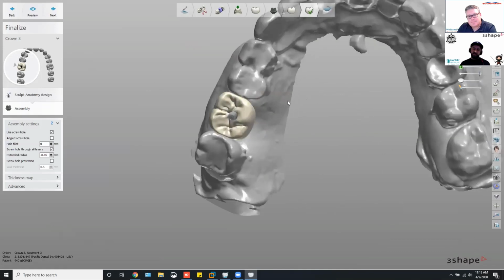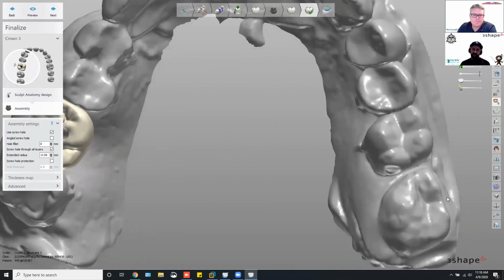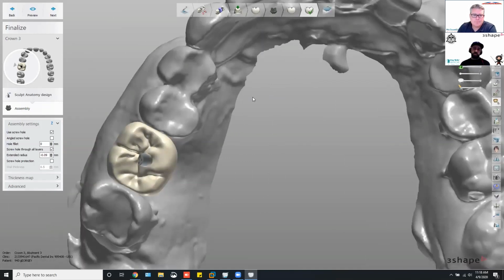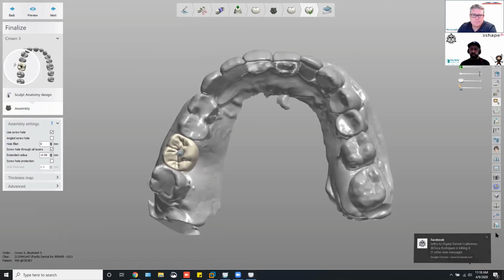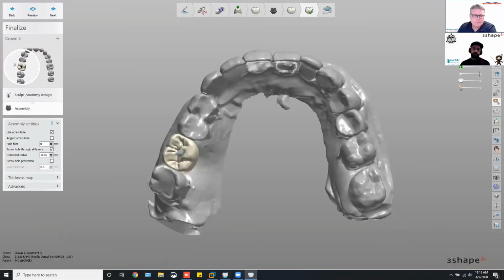This is just something I'm messing around with over here. You see, this one's got some anatomy. Don't know what's happening here, but this is wiped out. Was this because the doctor's impression was horrible? Who knows? Intraoral scans are probably going to be better at that. I think finding out what anatomy library works with each case is key. A lot of labs will do that.